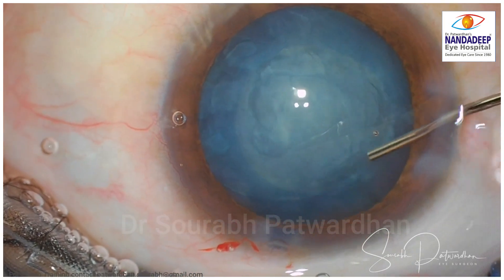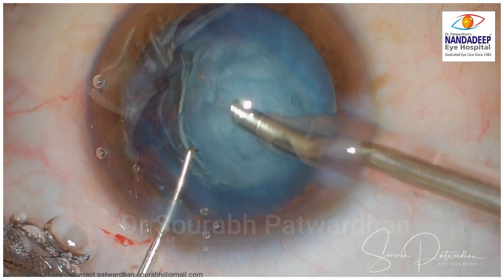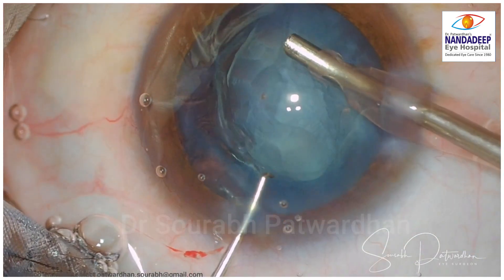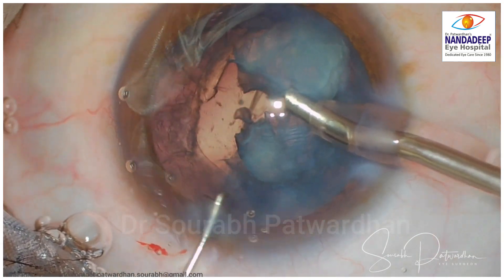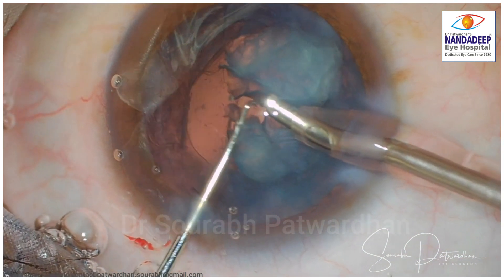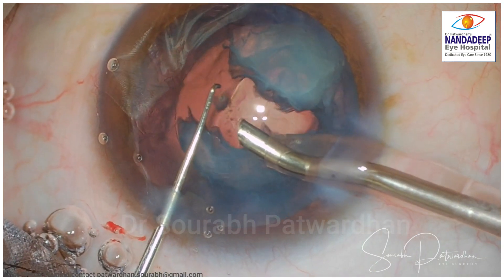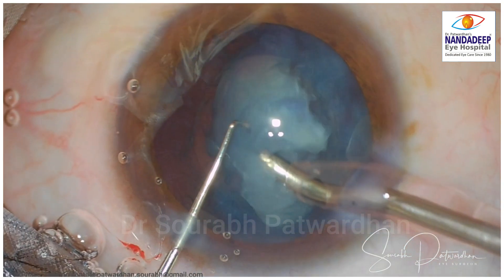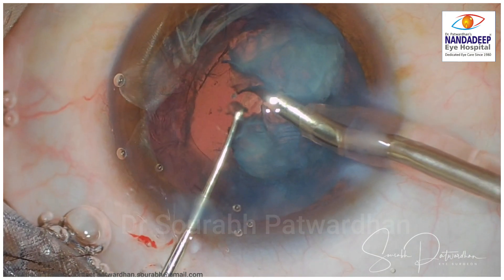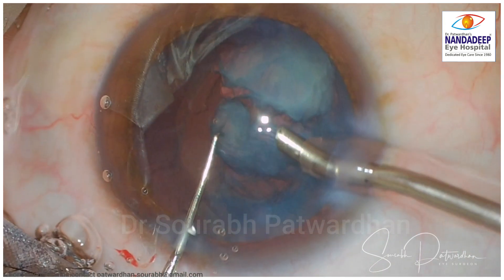There is some cleavage between the capsule and lens material and now I start the phacoaspiration again. You can see the nucleus is separated and I can aspirate it easily. But as soon as the nucleus gets dislodged from the back, you find that there is a posterior capsule rupture — you can see an edge of the PC tear there. It is already open and it is getting enlarged if I try to aspirate more. At this point I immediately stop because if I continue there is a chance that vitreous will prolapse.